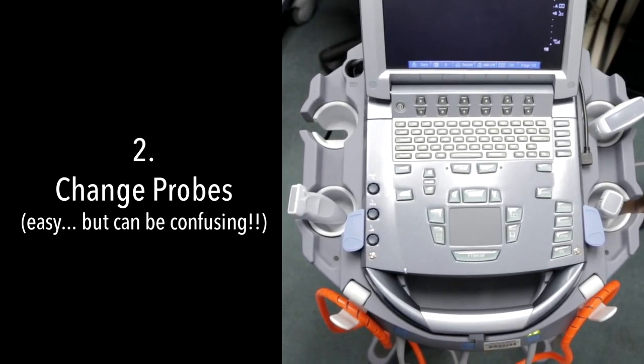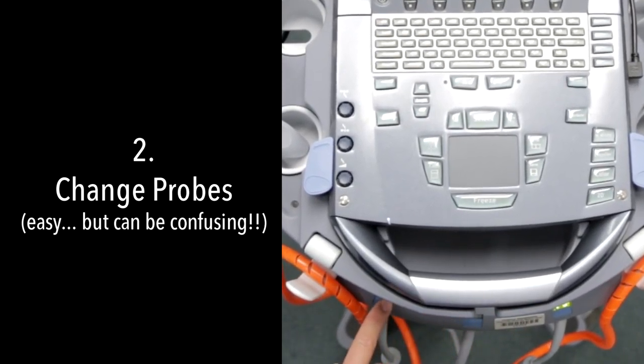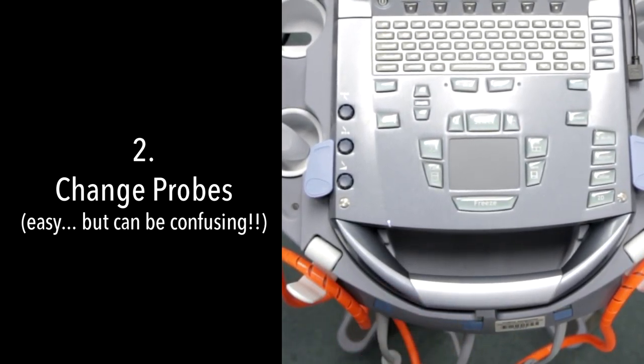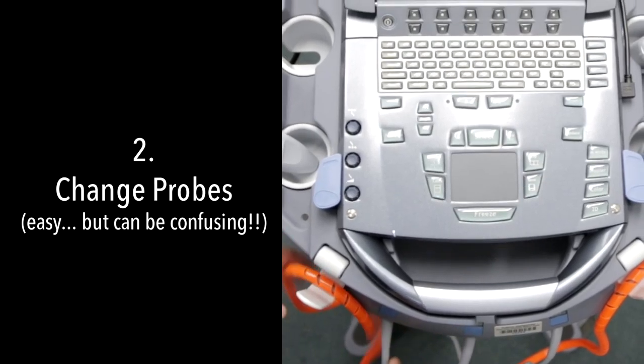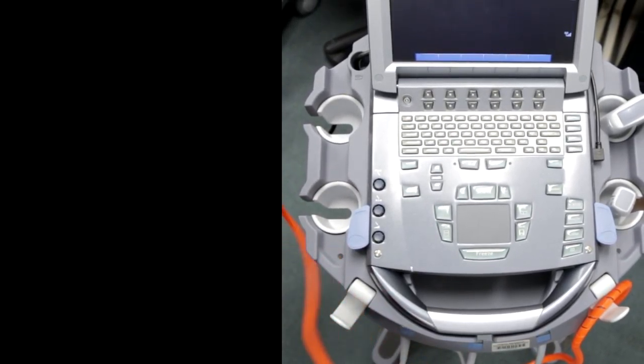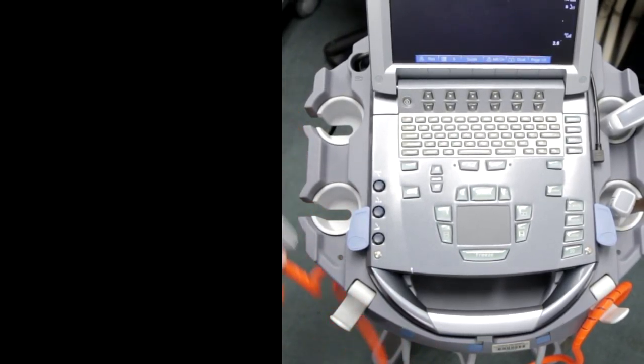If you need to change probes, there are buttons right here that correlate. Right now when I push that, this changed over to the linear probe. Whatever probe is connected to that button is what it's going to change to.